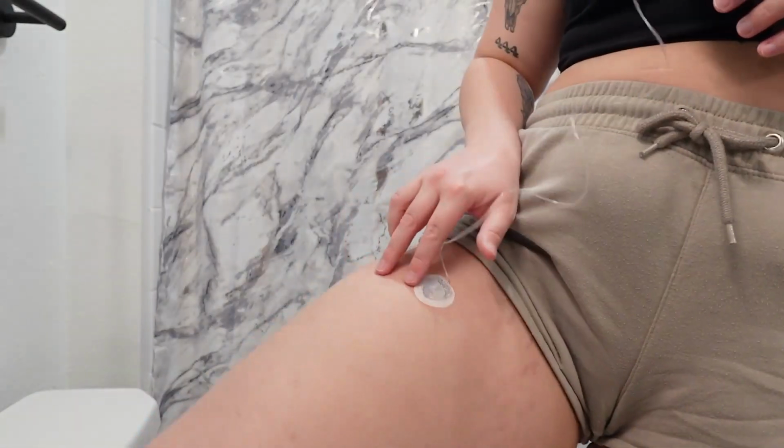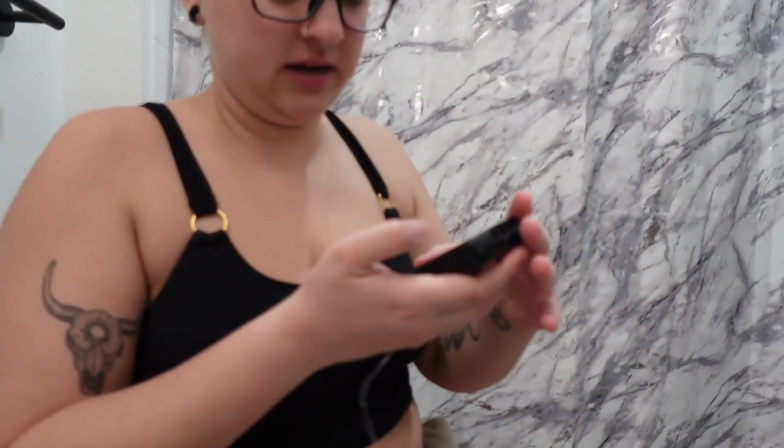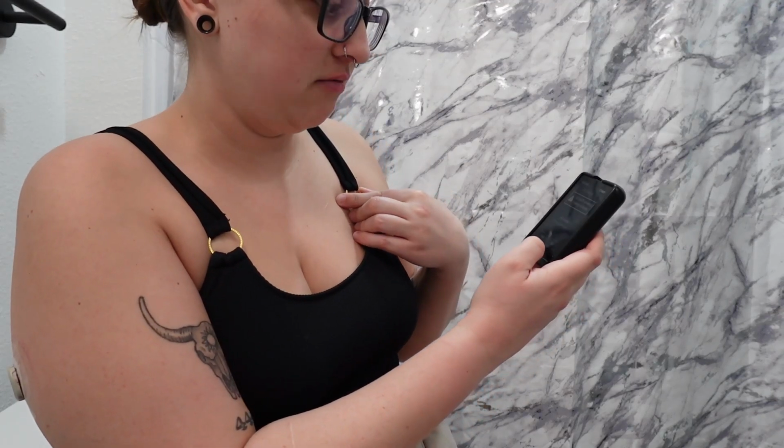Okay. I think she will be okay. Look, that needle is what goes in my skin for like a solid millisecond. All right, cap her up, and we've got a new site right here. I think I did pretty good. And then I ejected 10.7 units, which is awful. If you know that this cartridge does not hold much, I'm serious.